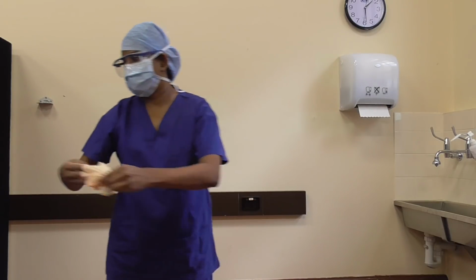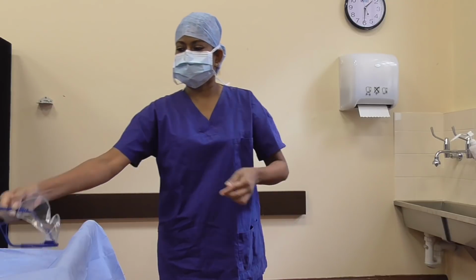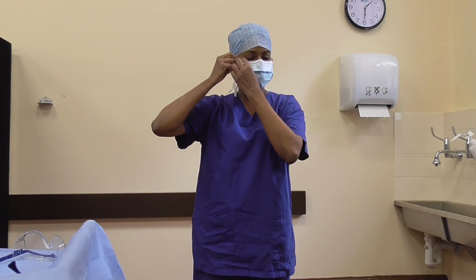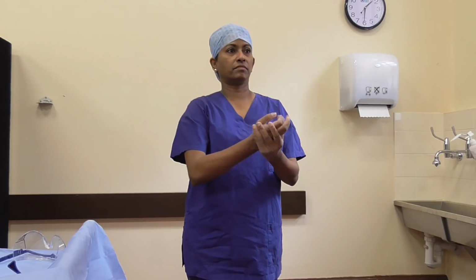Discard the gloves in the bin and perform hand hygiene. And then remove your goggles and mask. Perform hand hygiene again and the decontamination process is complete.